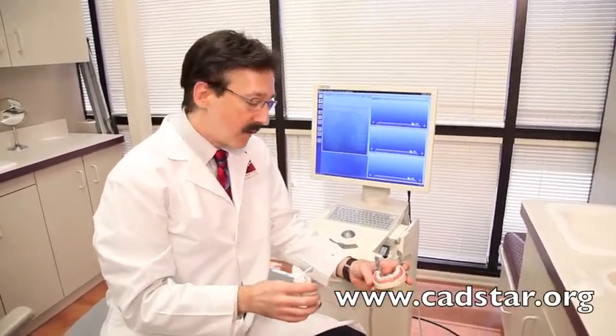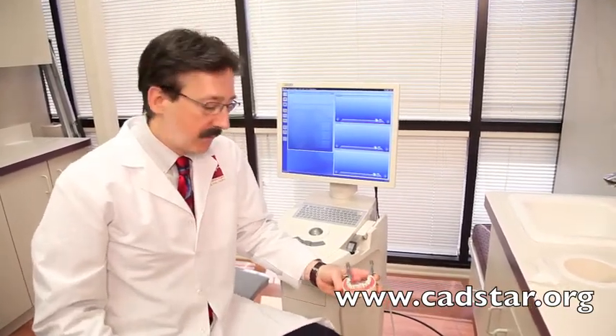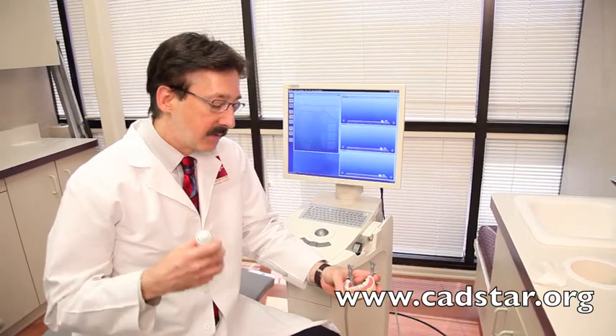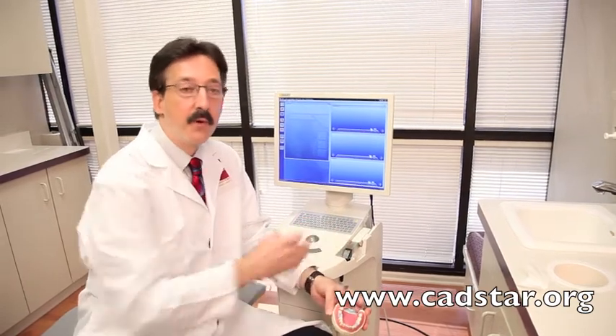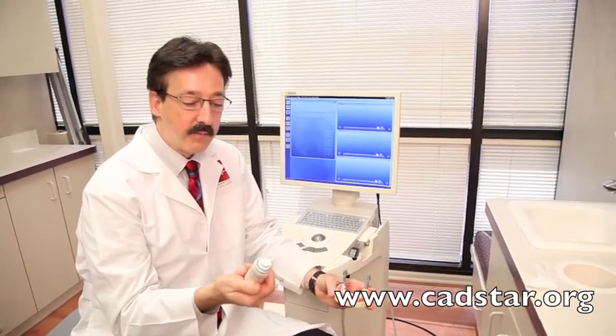We do need to put a reflective medium on our teeth, and in some circles that's being suggested that maybe that's not as ideal, but you'd be surprised how fast this is. The Serona system has decided to stay with this type of reflective surface because these cameras are faster and more precise, because they have a shorter wavelength.